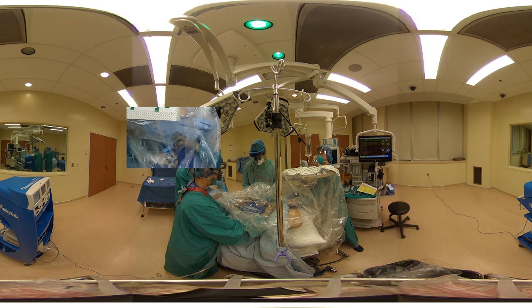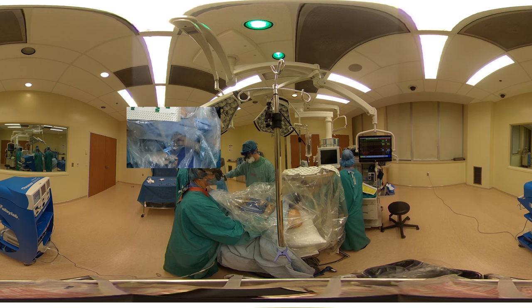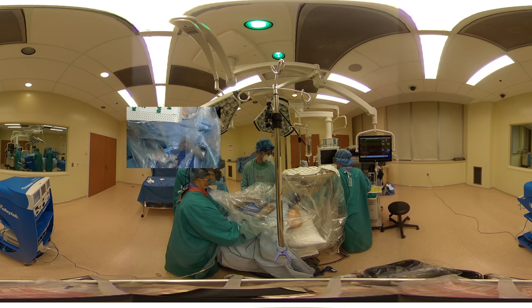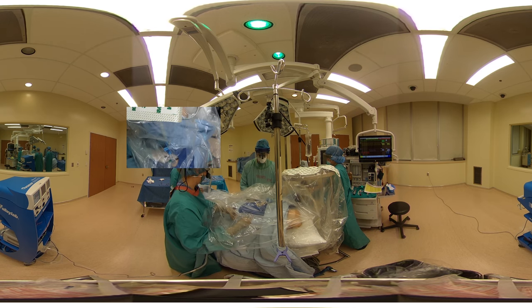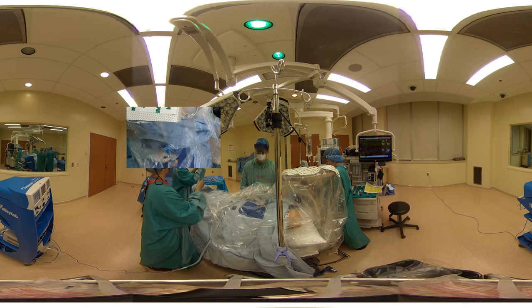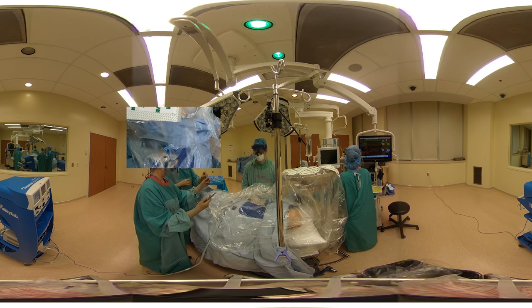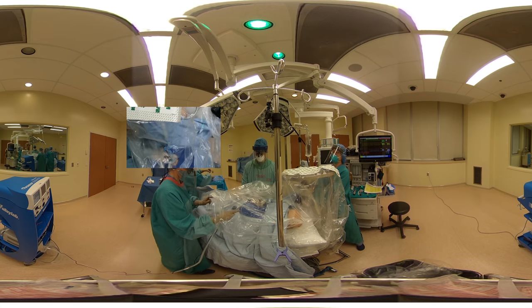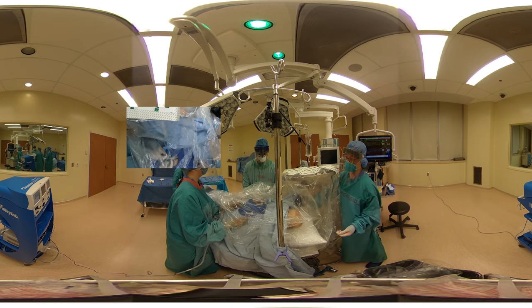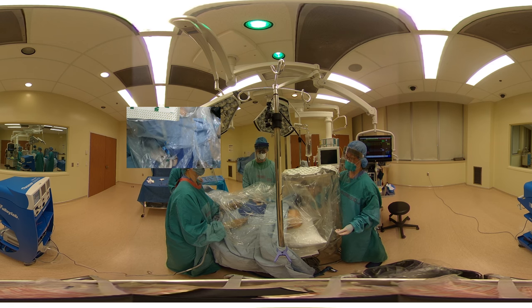So we'll induce general anesthesia with paralysis now. John, you're going to go off to sleep. Got the tube? Got the tube — we'll hold it in place. I'm inducing now, John. Put the propofol in. We can now secure the tube with sutures and with the Velcro tie. We have to be very careful when docking the tent to minimize spray.